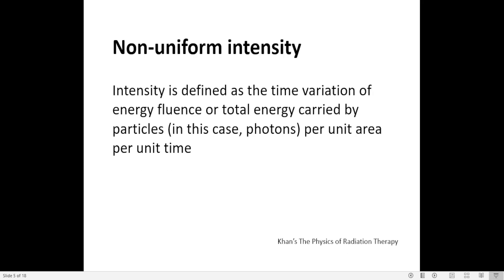Non-uniform intensity. Intensity is defined as the time variation of energy fluence or total energy carried by particles, in this case photons, per unit area per unit time.